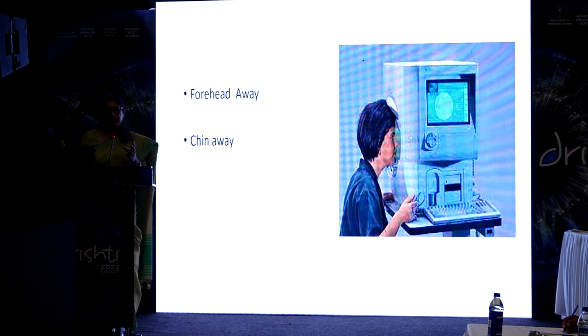You can get a similar defect if the forehead is away from the forehead bar, and a defect in the superior field if the chin is away. So a constant monitoring of the position is very important during the test.